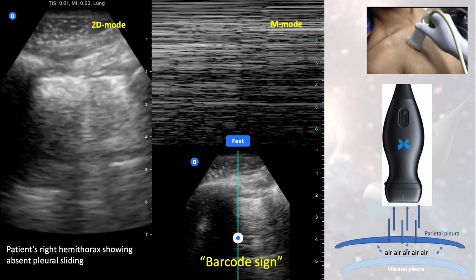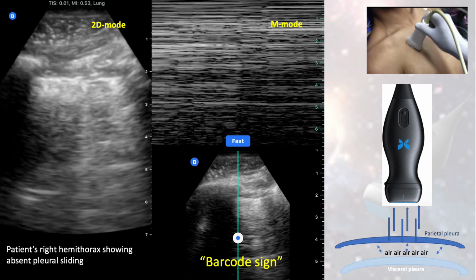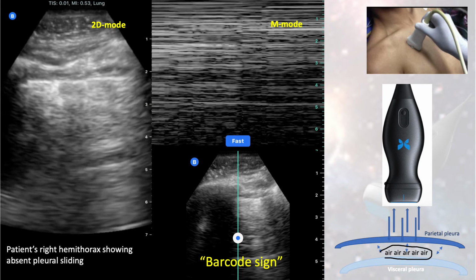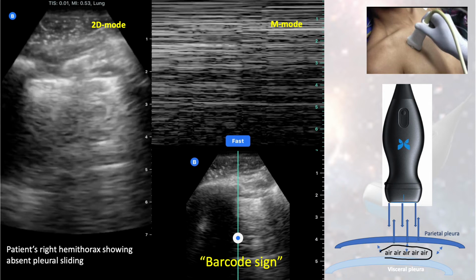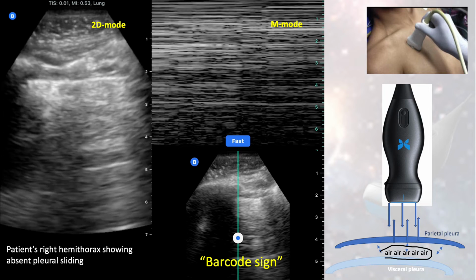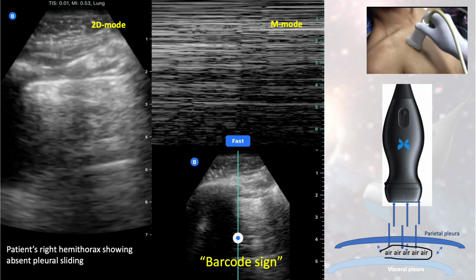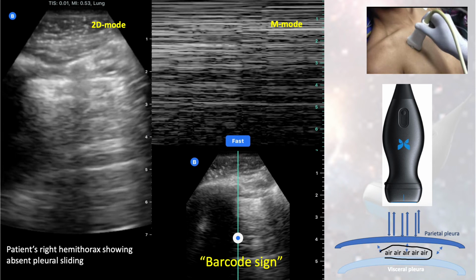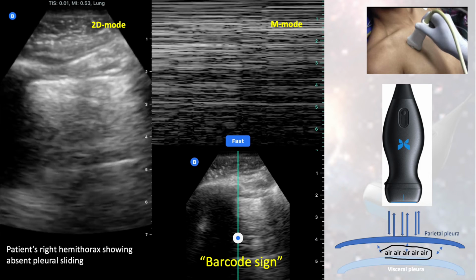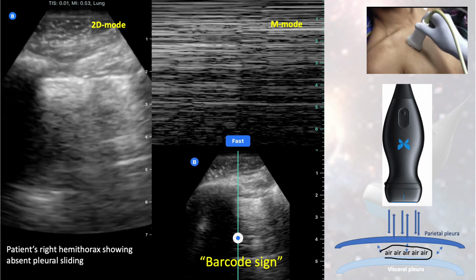Compare that to the findings on this right side of the patient where the pneumothorax happened. So air is the enemy of ultrasound. When there's air in between the parietal pleura and the visceral pleura, air will basically scatter ultrasound beams all over the place, and very few, if any, will reach the moving visceral pleura. What will be reflected back to the probe and detected are the beams reflected from the parietal pleura, which covers the underneath of the thoracic cage, and basically it doesn't move with breathing, so it's static.